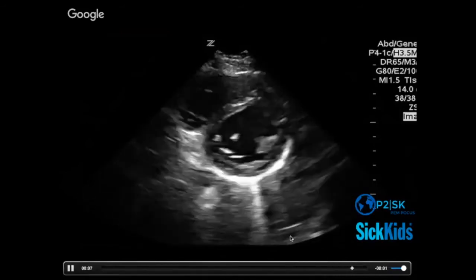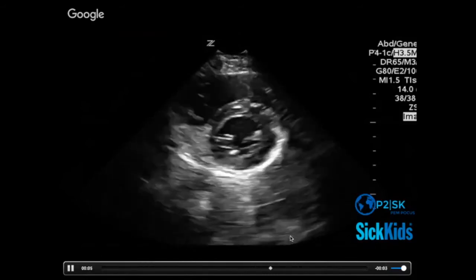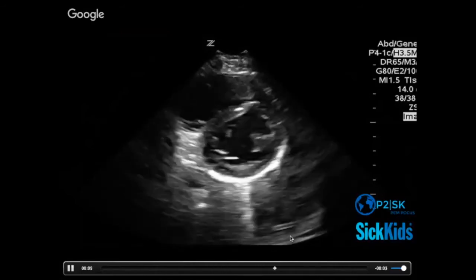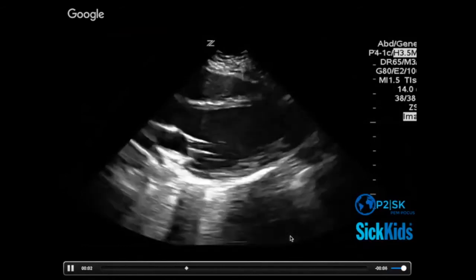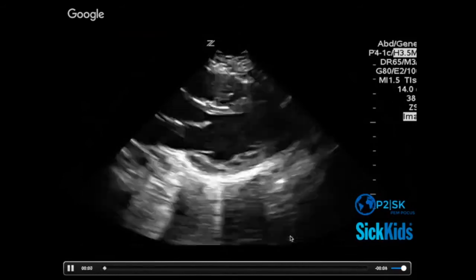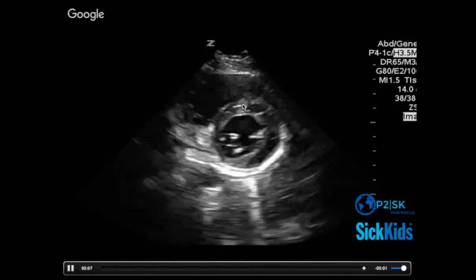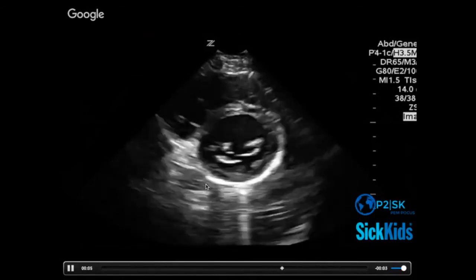And in the parasternal short, what do we use the parasternal short for? What does it tell us? Function is one. Right-sided pressures are another. And then if you were treating adults, right-sided pressures, yeah. And Greg says it can tell you which vessel is causing their heart attack. So regional wall motion anomaly. So one part of the wall is not squeezing. You can map that back to vessels.